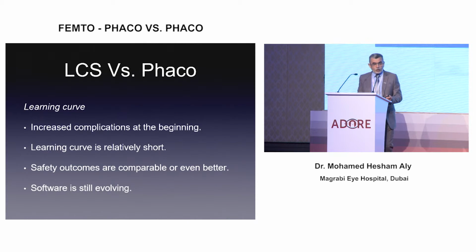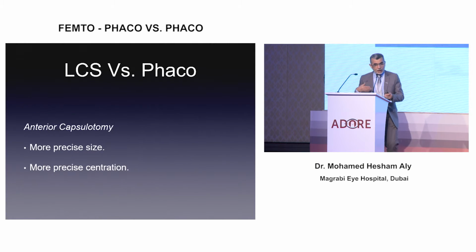The safety outcomes are comparable, if not better, than the phaco. The software is still evolving. In our LenSx, we have had 4 software upgrades in the last 6 years, and every upgrade has its own advantages, so it will make our life even easier.